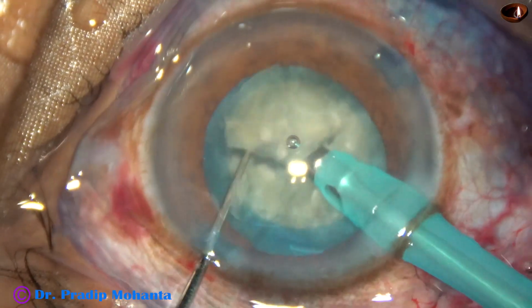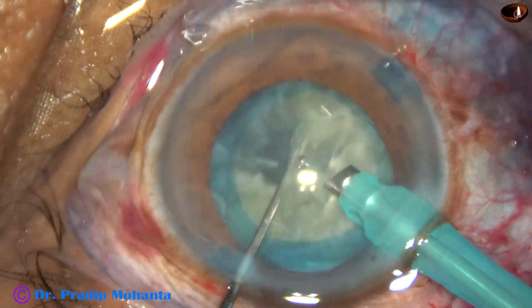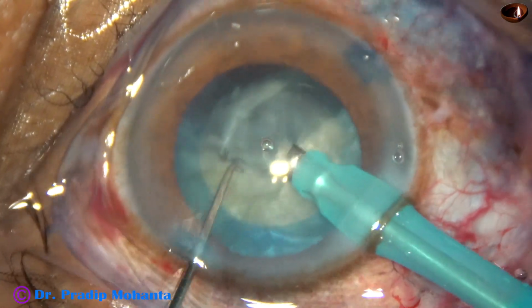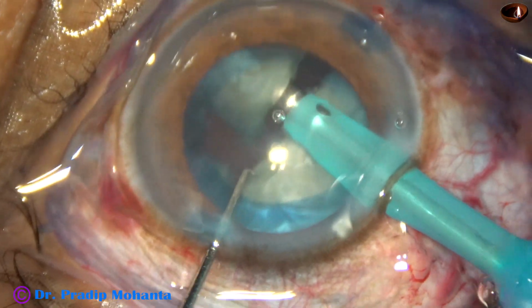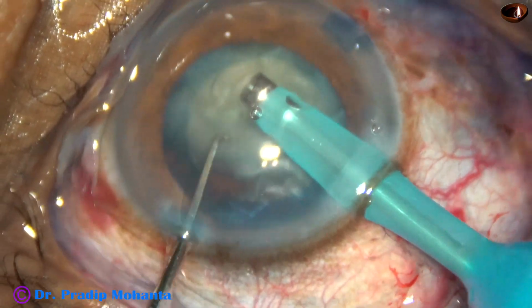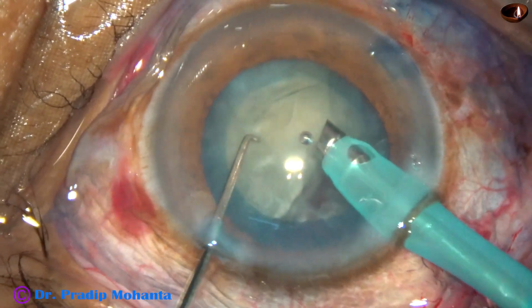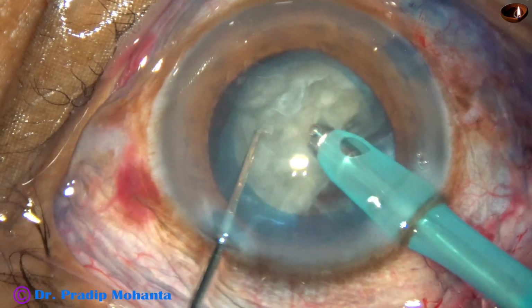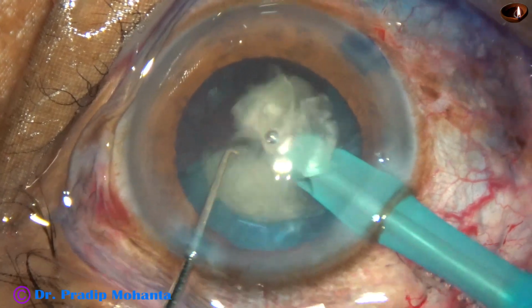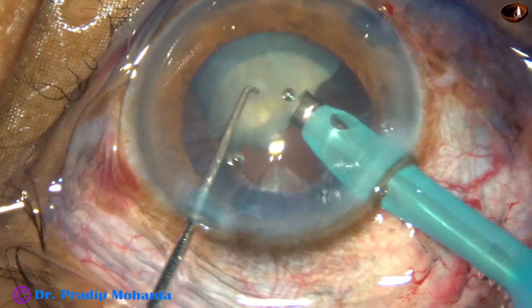Each nuclear fragment is emulsified with ultrasonic energy, which is 60% in this case. Flow rate is 45 ml per minute. Vacuum is 450 mm of mercury, and this is Catarhex 3 from Oertli, Switzerland. This is the heminucleus. It is chopped, and this is the last nuclear fragment.